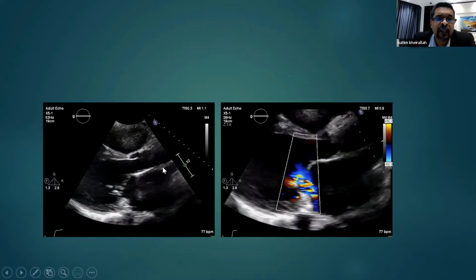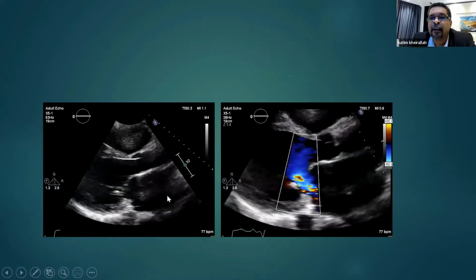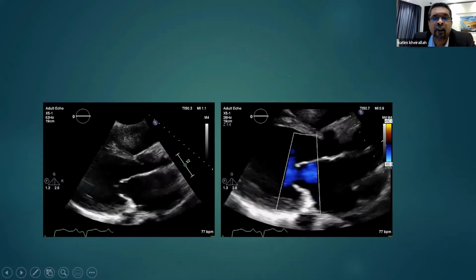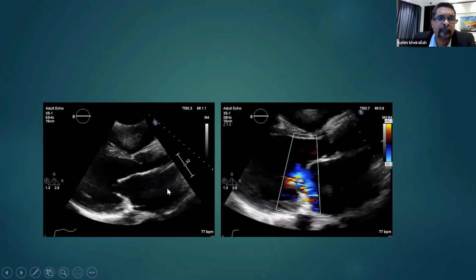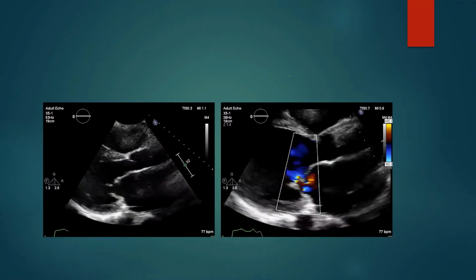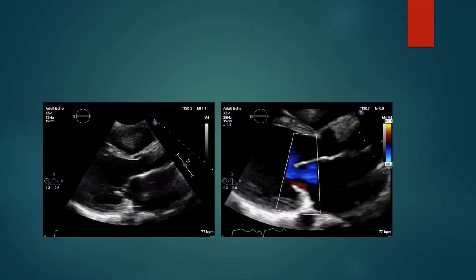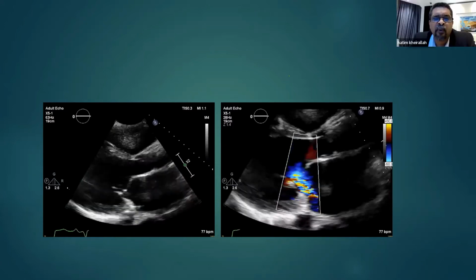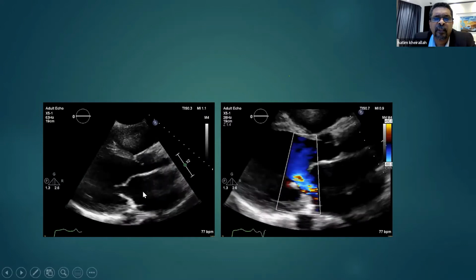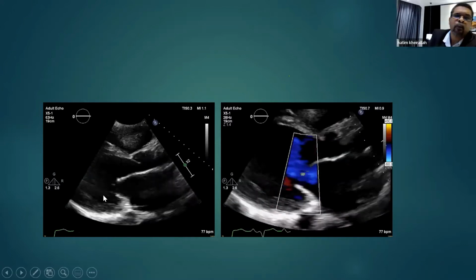I'm gonna challenge flail. Fikri and Rayan, if you want to support Fikri, this is not a case of prolapse. I think it is thickened and stiff. There is something moving with the anterior mitral leaflet inside the left atrium, I think. If you think that's the one, this is not. This is just an artifact. But if you focus now, look here.